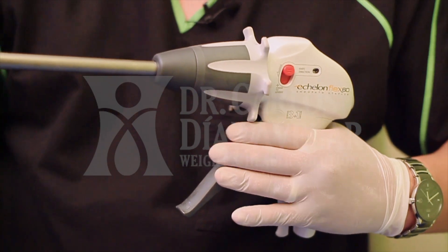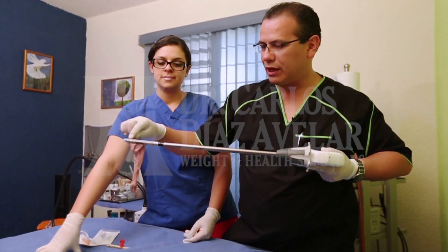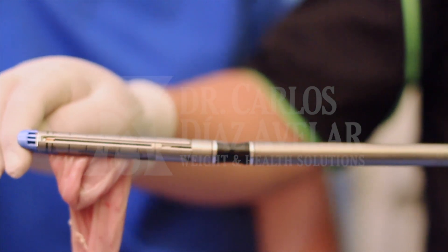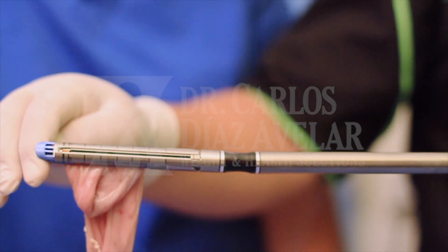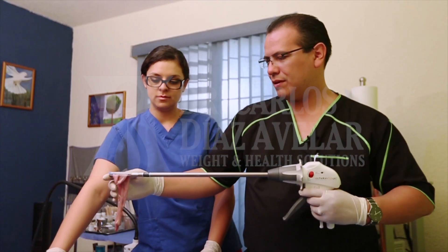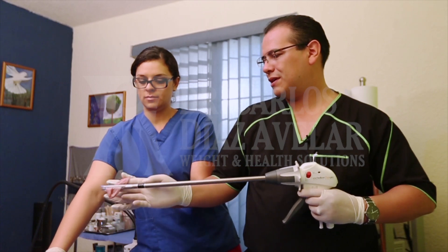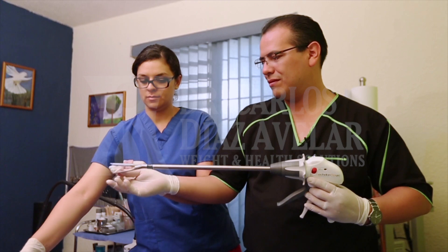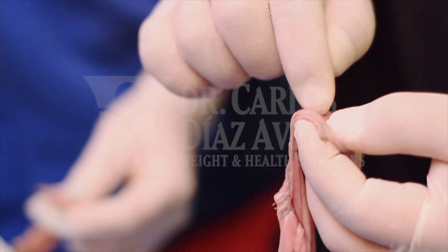And then he is going to cut. There is a blade — when he pushes the blade, it will run into the top, as we can see in this example. Again, the intestines are perfectly safe and sealed. As you can see, Dr. Villas provides complete safety and technological innovations to his patients.